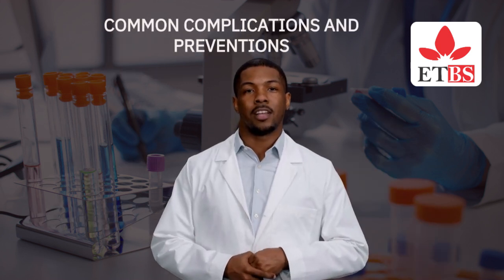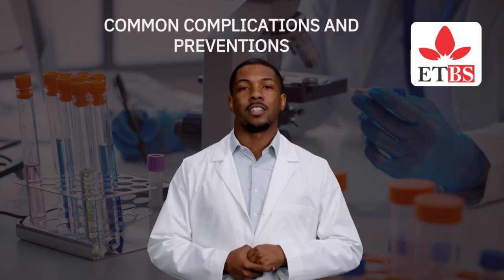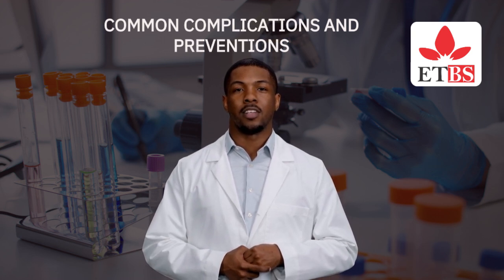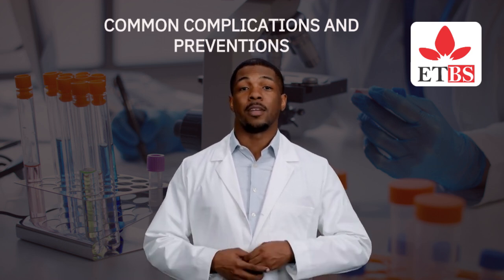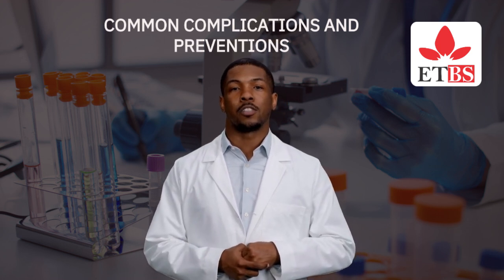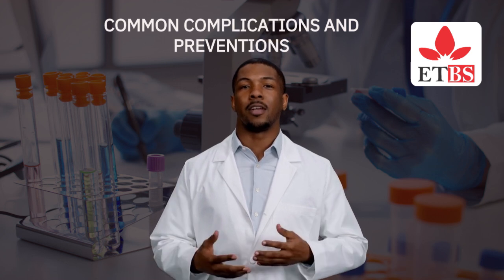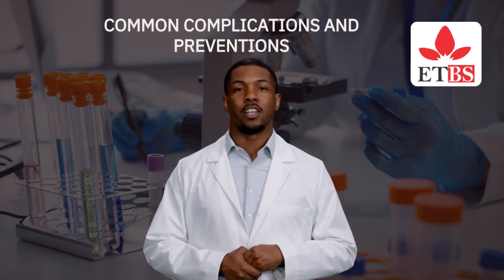7.7 Common complications and preventions. Complication, cause, prevention. Hemolysis: squeezing site too hard; allow free blood flow. Contamination: poor site prep; proper cleansing and technique. Inadequate sample: cold site or improper depth; warm area, use appropriate lancet. Osteomyelitis: deep puncture in newborn's heel bone; use proper site, medial lateral only. Hematoma: excessive milking or pressure; gentle handling, firm pressure post-procedure.